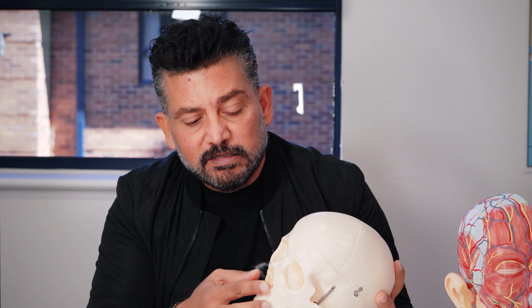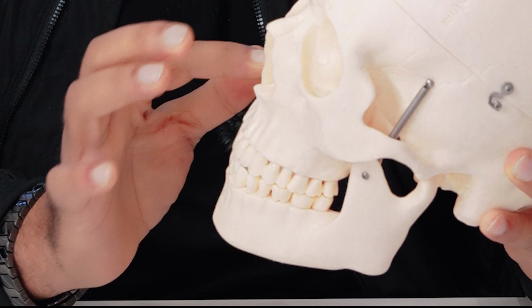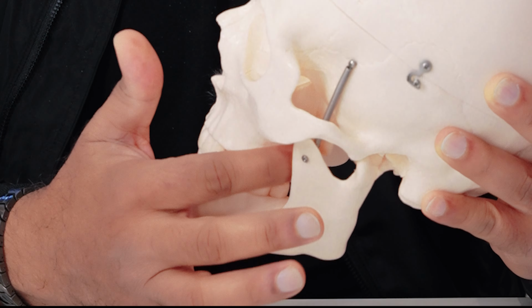So when we're talking about, for example, optimal balance of compromises, we have to work with what we've got left. We can avoid things like bone grafting, which is an additional surgery, which I prefer not to use. And in fact, I find far more success using native bone than grafted bone. Why? Because native bone is already attached to you and already has a good blood supply because it's part of you right now. And that's what we need for the process of osseointegration to happen.